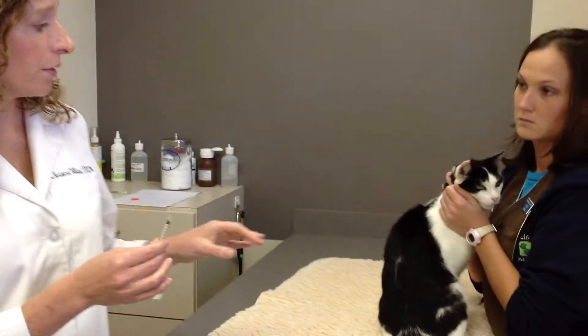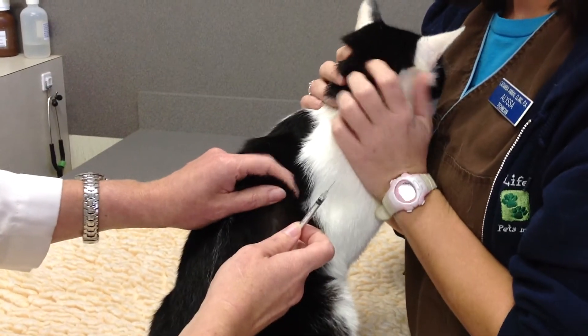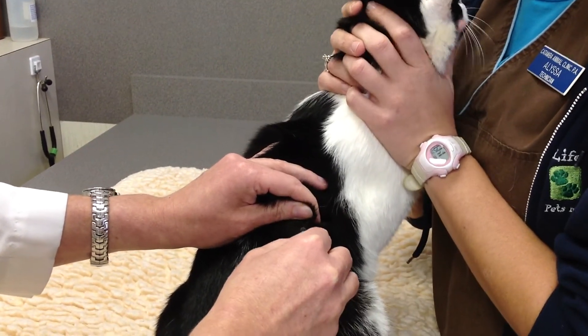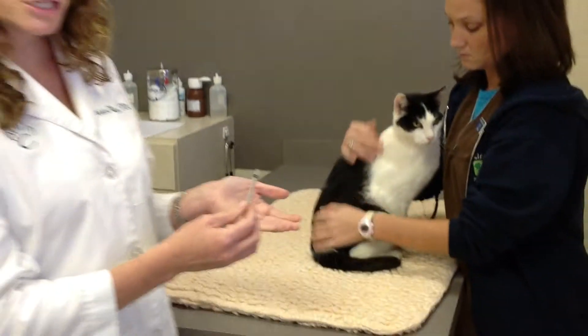Insulin injections are given subcutaneously, which means under the skin, anywhere on the pet's body. I like to pick an area where the skin is nice and loose and I can tent the skin. I'm going to fold his hair back so I can see, insert the needle into the skin, and depress the plunger. Wiley has now had his insulin injection.